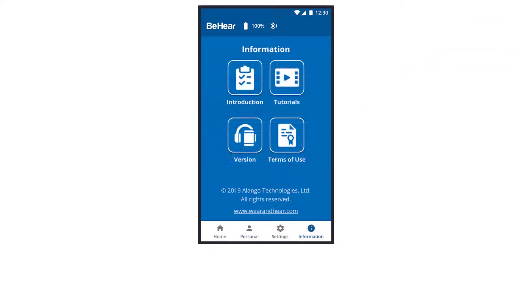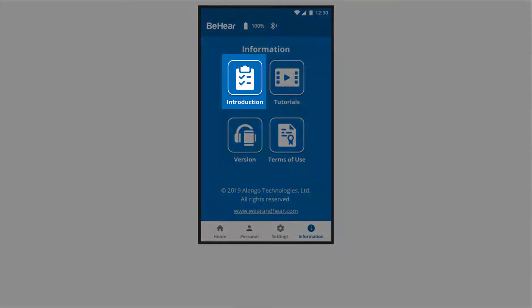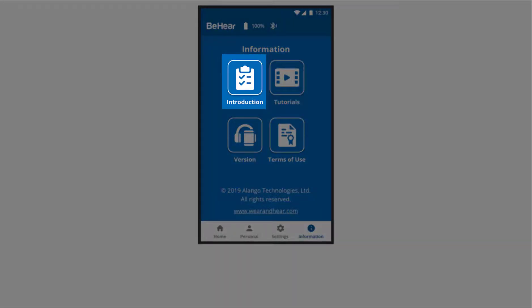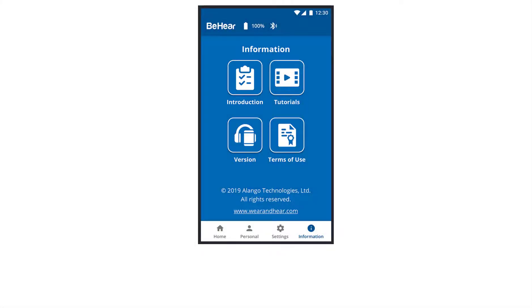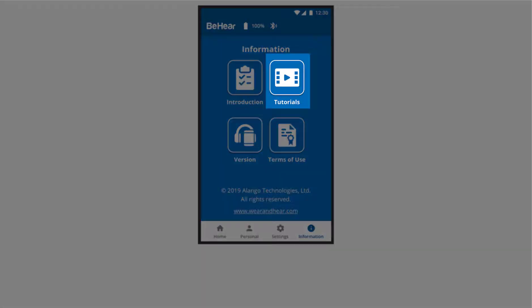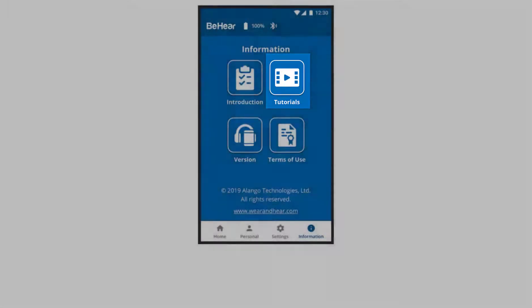The app's information section contains four icons. Introduction, which gives you a quick overview of the features in the three main hearing modes: personal hearing, phone calls, and audio streaming. Tutorials, which contains a link to our YouTube channel How-To Videos playlist.